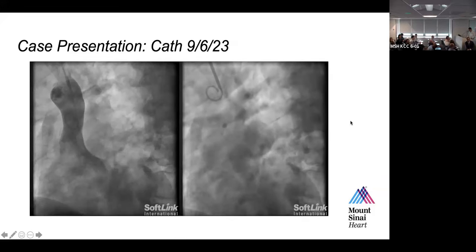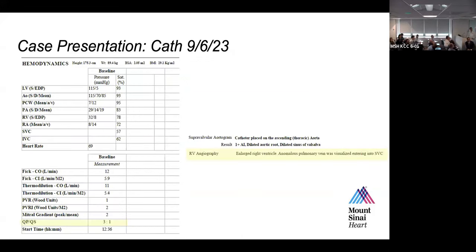And the shunt calculation was very important. What did we calculate the shunt to be exactly? Exactly 2.5 to 3 to 1. It's higher than the MRI, and we can maybe talk about that. That begs the question of how you decided mixed venous, but we'll put that aside.